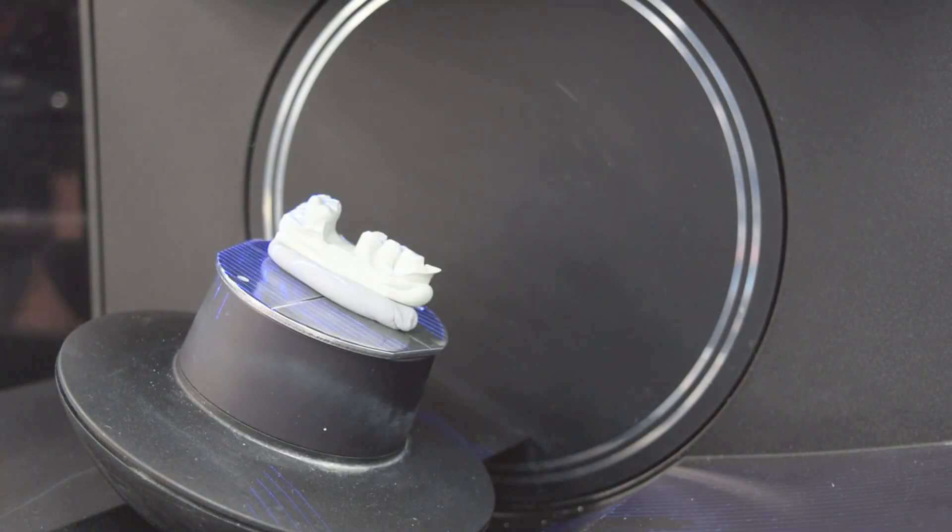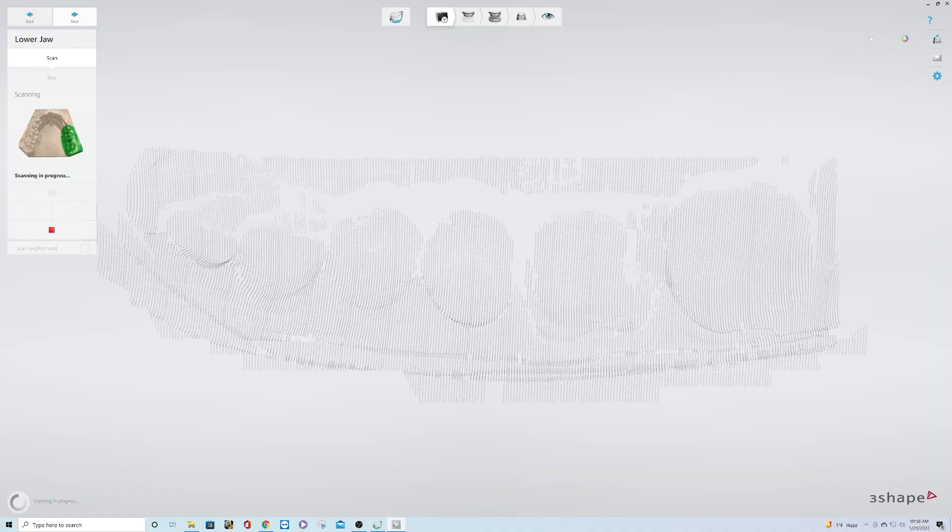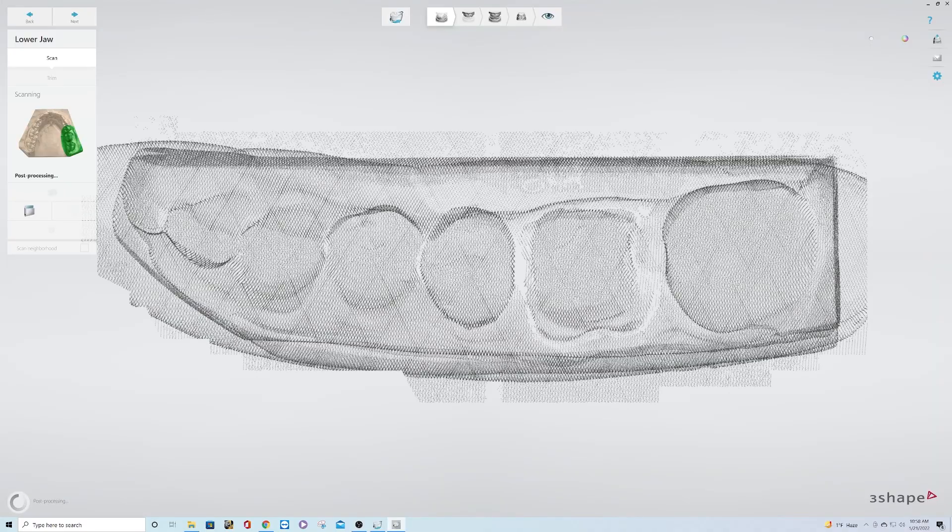Once the models harden, they are scanned into a three-shaped design software using a three-shaped bench top scanner.